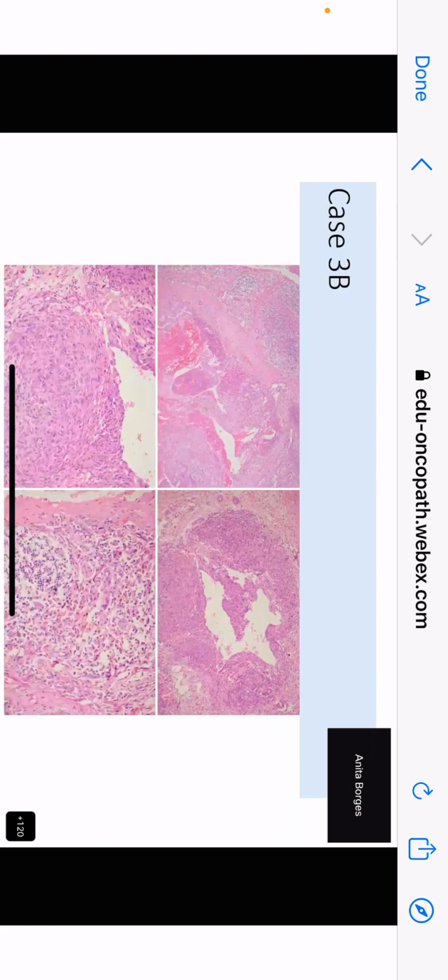All right. So now we come to 3B. Come on, Vimi. You see this? Yes, ma'am. Now come on. Just like we described there, just put it into one sentence. What you are seeing, and then you will reach the diagnosis. This is an 8-year-old child with a recurrent lesion in the arm, which is nodular, which has cells with a minimum amount of pleomorphism.